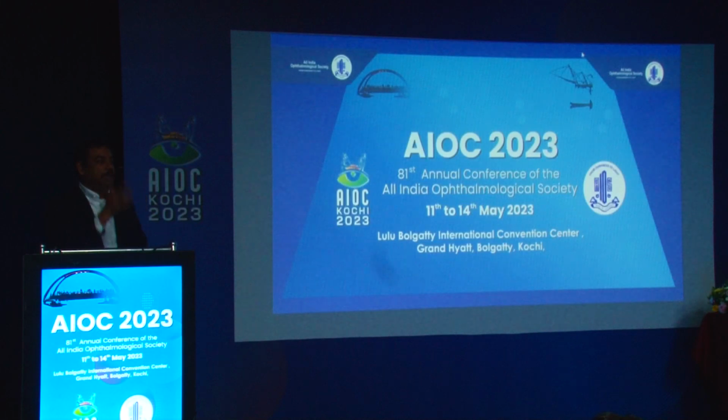The indications for micropulse as a primary therapy are different, and for SLT completely different. We are not going to do SLT in those eyes where the IOP is 35, 40 or 45. Those patients I will definitely go for a micropulse, because with micropulse you must understand we can reduce the intraocular pressure, but it is not sustainable. You will have to go for a repeat procedure, either one time or 2 times. Then it works. The second probe, the type 2 probe, will not work in any patient.